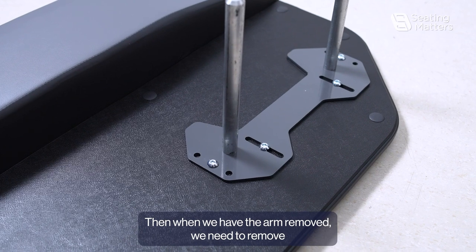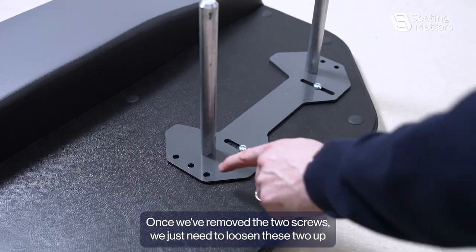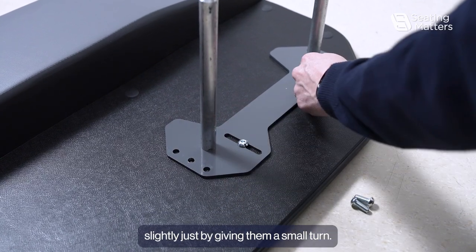With the arm removed, we need to remove these two allen screws using a five millimeter allen key. Once we've removed the two screws, we just need to loosen these two up slightly by giving them a small turn.